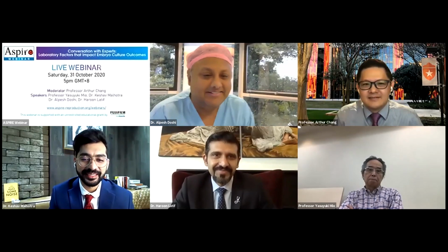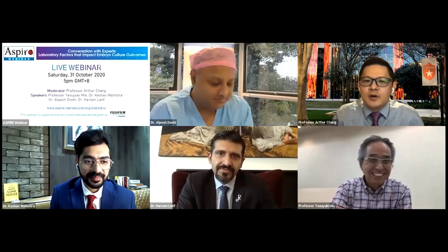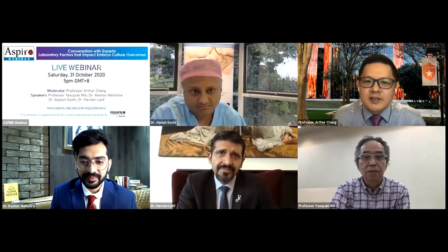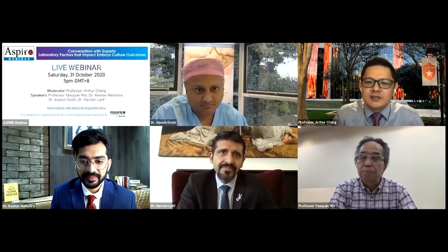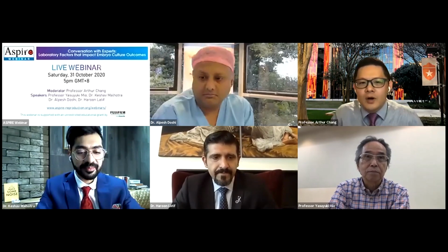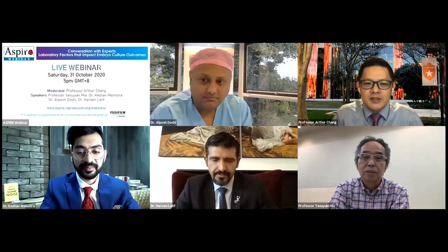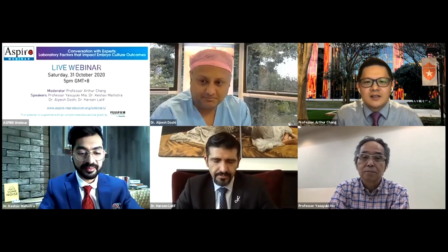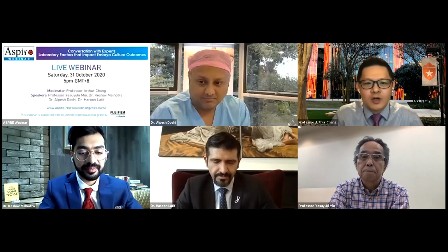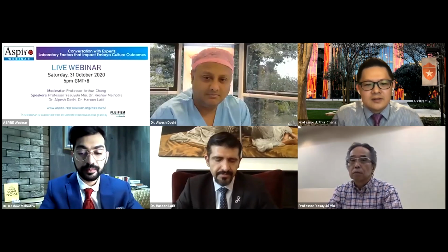So yes, I understand. Professor Mio, regarding the osmolarity increase during the culture, in your slides you mentioned that we should choose a medium starting at a lower level, like 260 to 270. While the companies will not tell us what they really put into the medium, what do you think the manufacturers' components are, and why do they make some of them lower osmolality and some higher than the others?